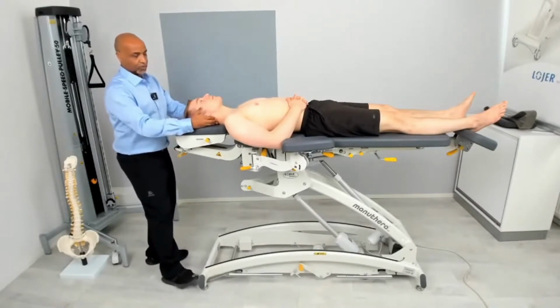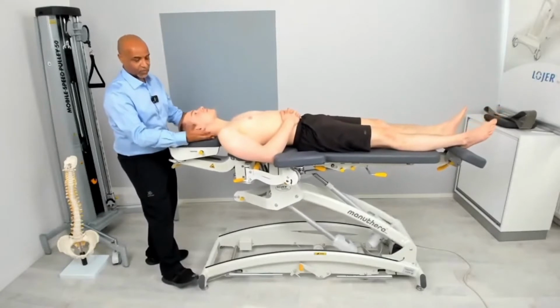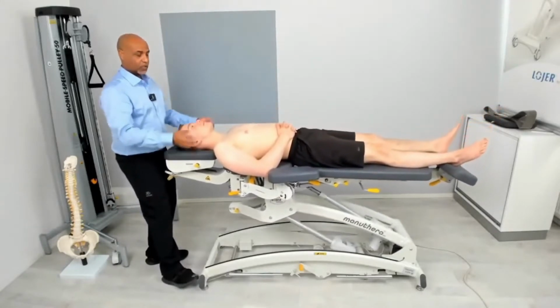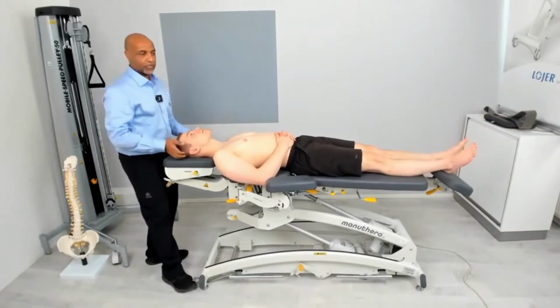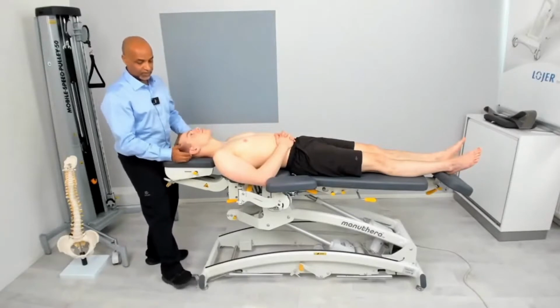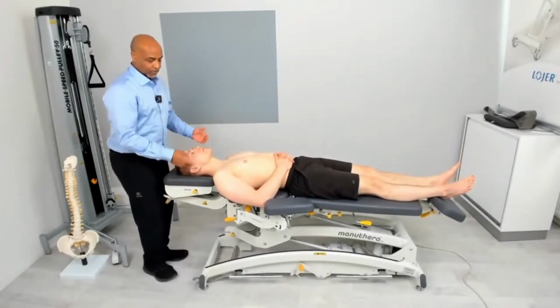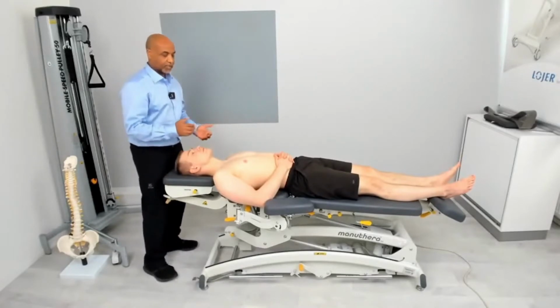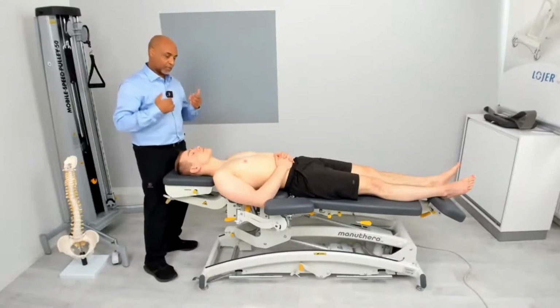This is the best approach when it comes to Manuthera. It assists you all the time with the tool. Instead of having a harness to pull, instead of having additional equipment for the neck traction, this is all combined in one. Then from there, we're going to start thinking about the second part, which is very common in the middle section of the upper back.